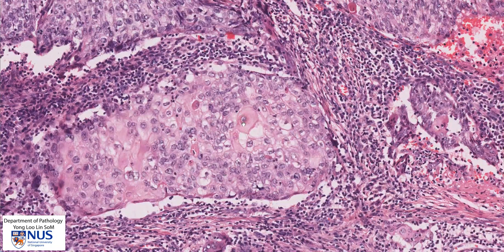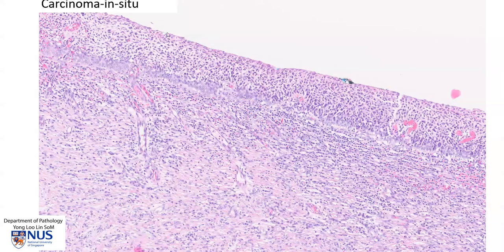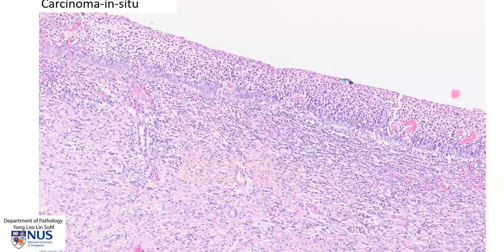In some areas there is a focal suggestion of individual cell keratinization. I want to do a very quick direct comparison with a case of squamous cell carcinoma in situ. This is a case where there is neoplastic change throughout the full thickness of the epithelium; however, the neoplastic cells are still confined by the basement membrane and we do not see any invasive tongues going into the underlying cervical stroma. This has a much better prognosis if completely removed, compared to invasive squamous cell carcinoma, which has the potential to metastasize.